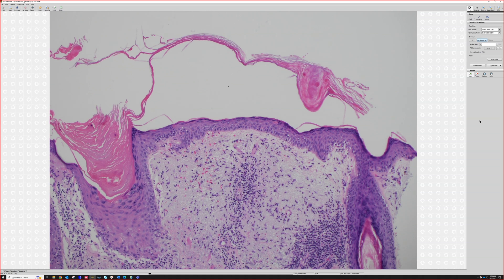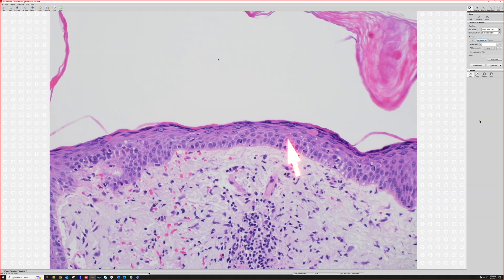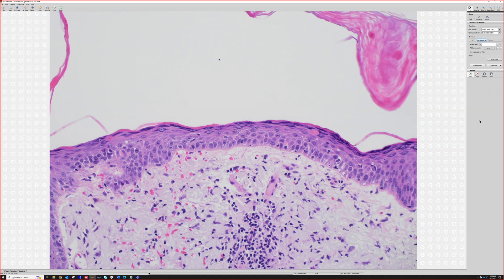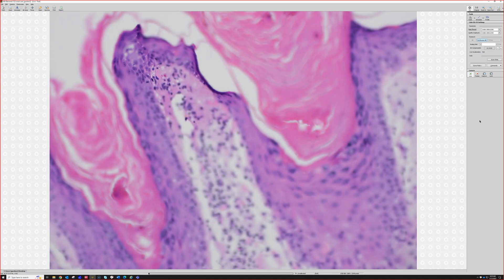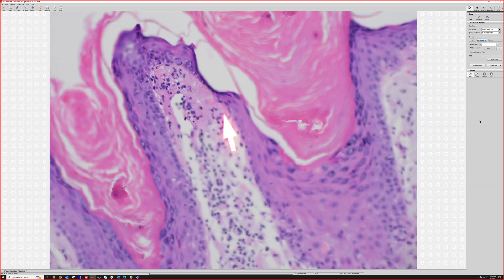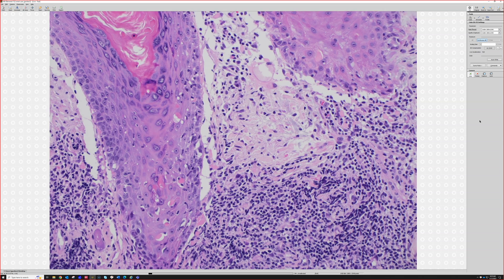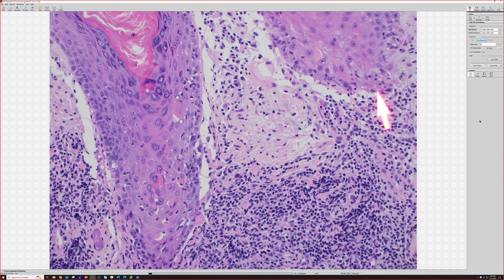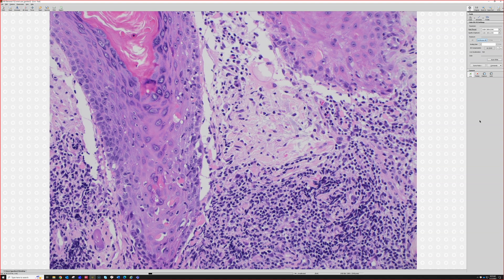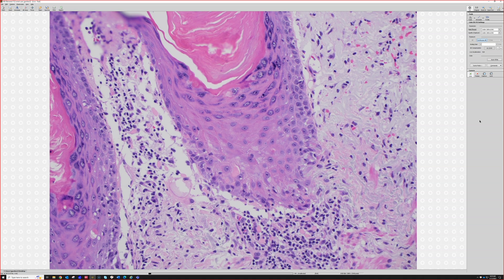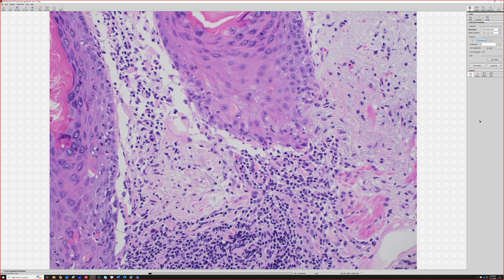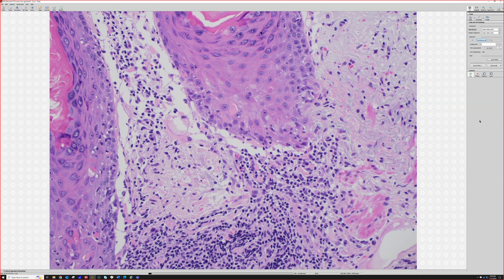Looking closer, there are occasional dying keratinocytes, though the basement membrane looks relatively clean in some areas — not much active interface going on there. But in other areas, there are multiple dying keratinocytes and the basal layer is becoming jagged, suggesting a burned-out interface where keratinocytes have died and the basal layer is disrupted. This extends down the hair follicle epithelium — interface going down a follicle should prompt thinking about lupus.